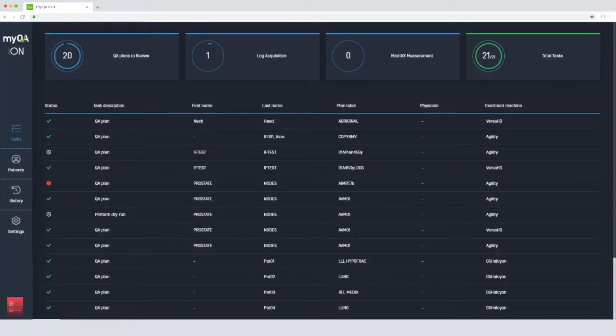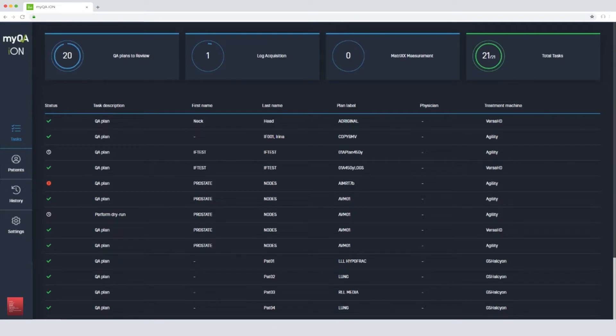MyQA ION is a web-based patient QA solution system for pre-treatment and during-treatment QA. We can access the software from any computer within the radiation therapy department.